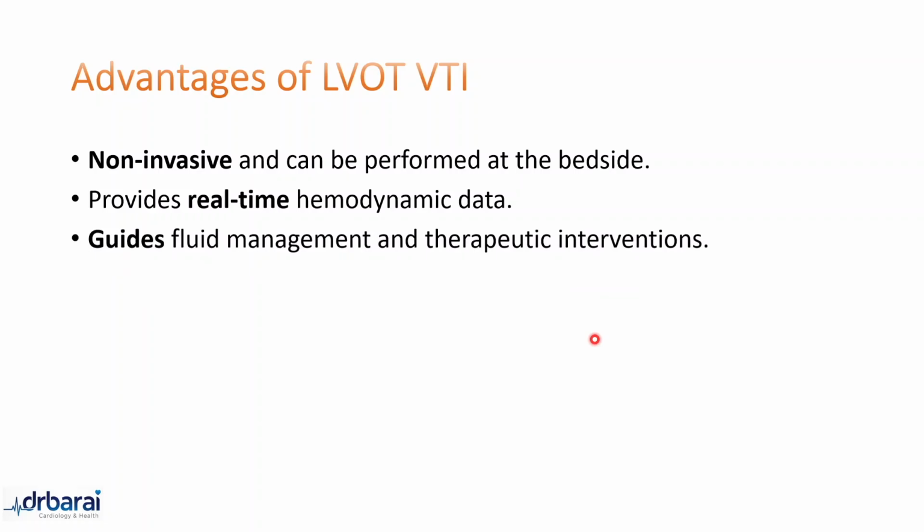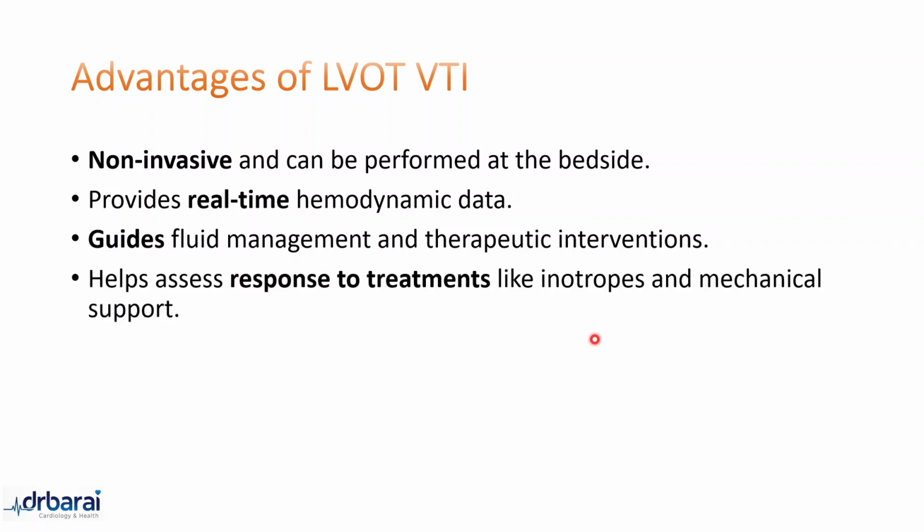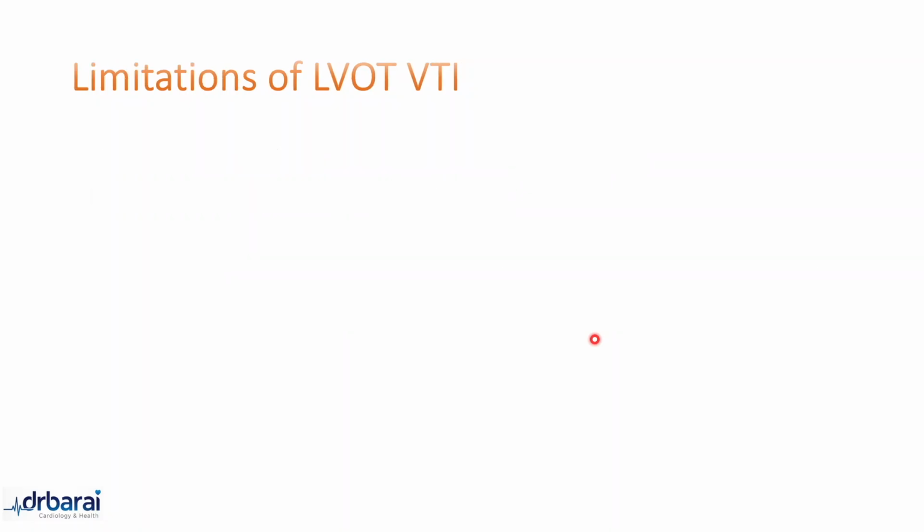Whether we do fluid management or a therapeutic intervention like thrombolysis or giving some vasopressor support, we can take the decision based on the LVOT VTI. If we give some treatment, whether the person is responding to the treatment can be assessed through the LVOT VTI.